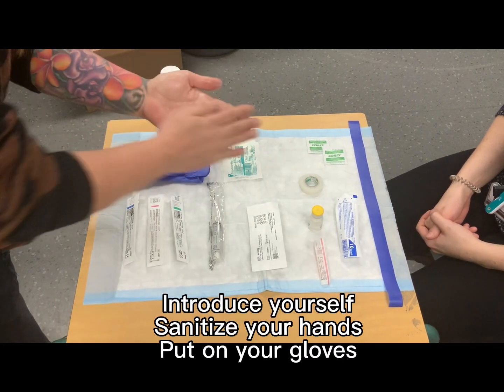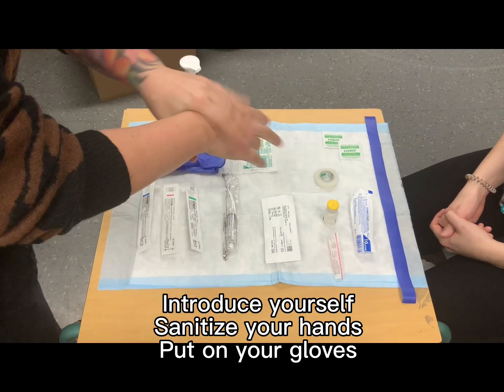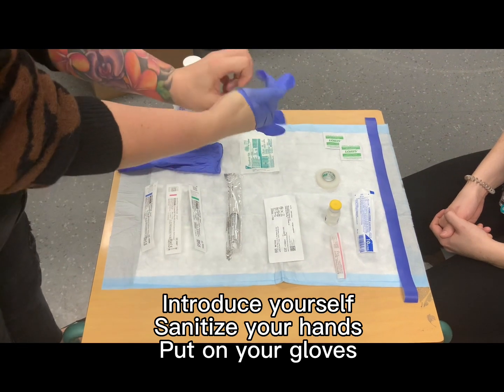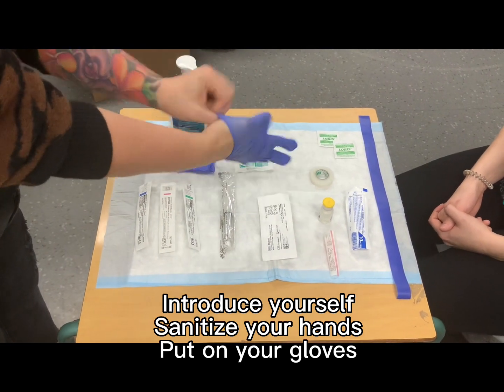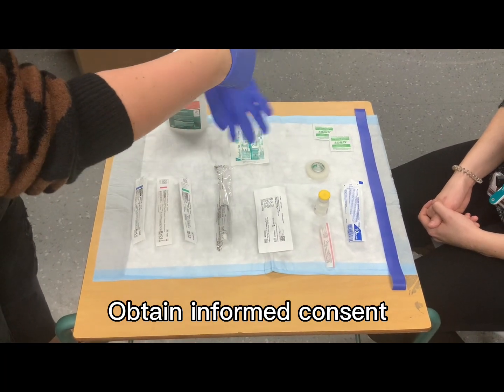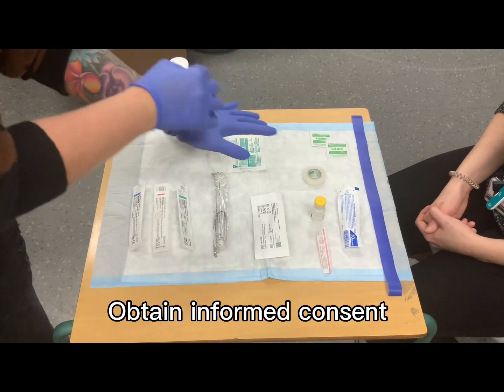While introducing yourself, sanitize your hands and put on your gloves. Explain the procedure to the patient and why it's required. Ask for their permission. This is obtaining informed consent.